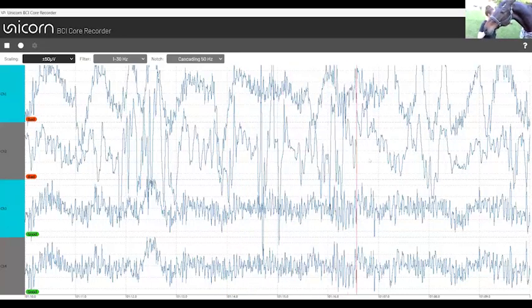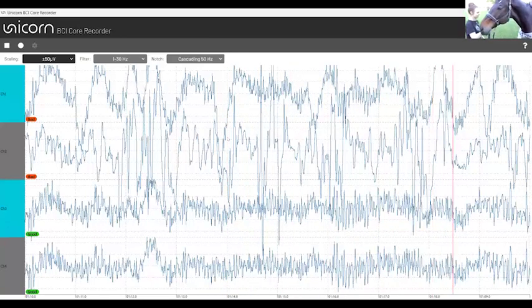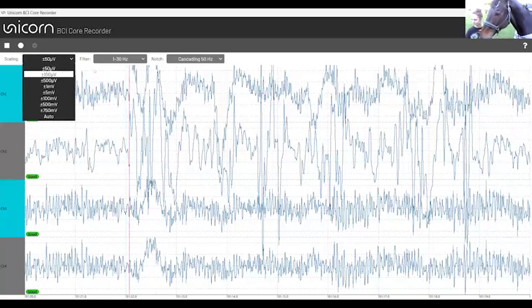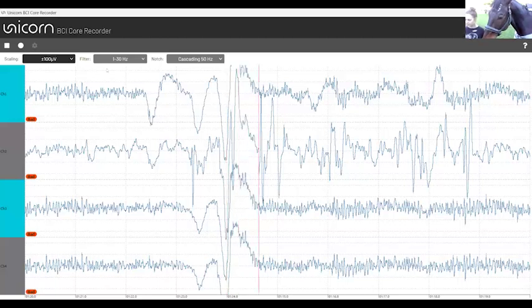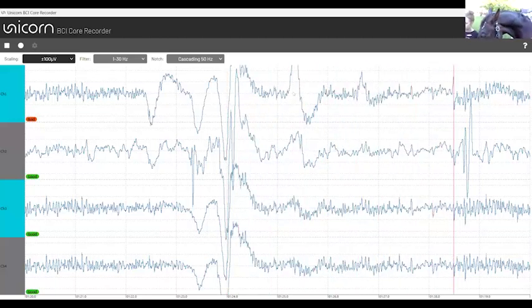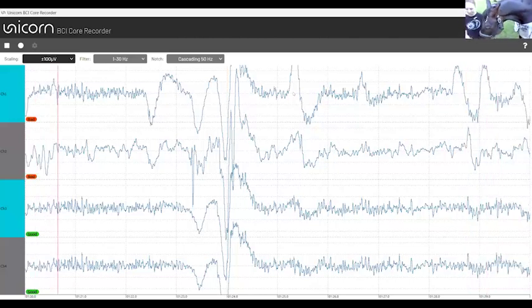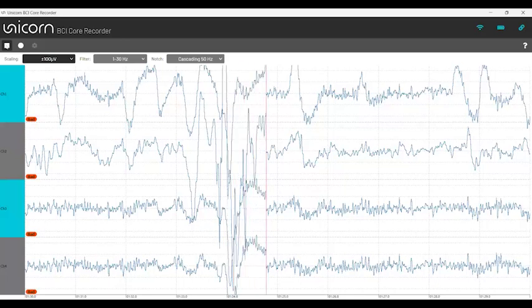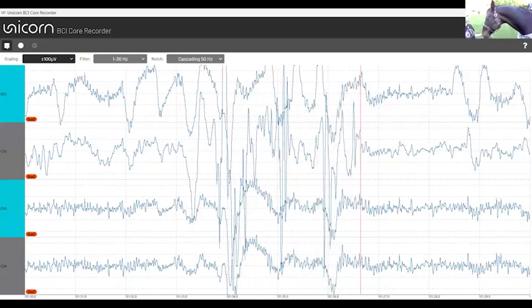Channel 1 and 2, maybe I need to check the attachment again a bit. And yeah, we have a scaling of plus minus 50. Maybe we also have a channel 1 eye blink. Can you ask him to blink? Maybe we can close the eyes.